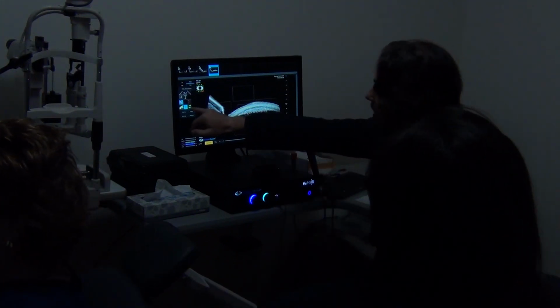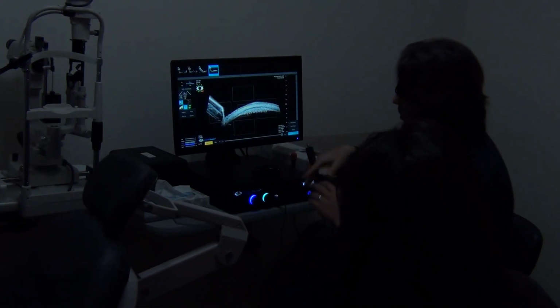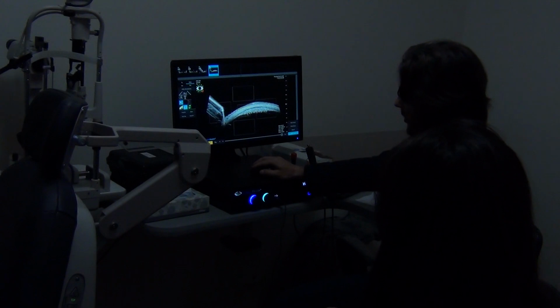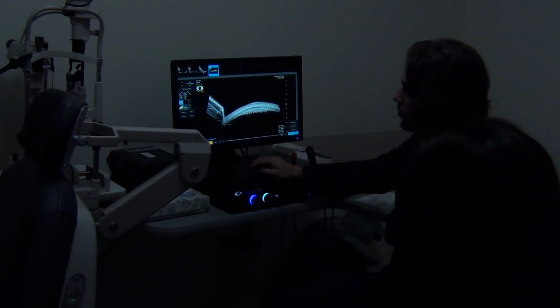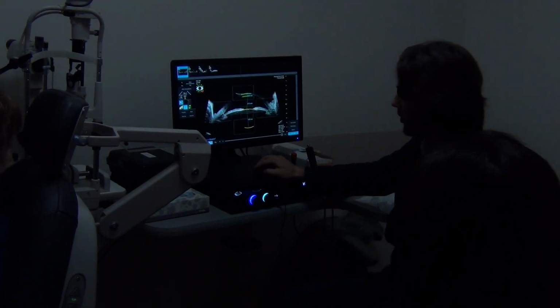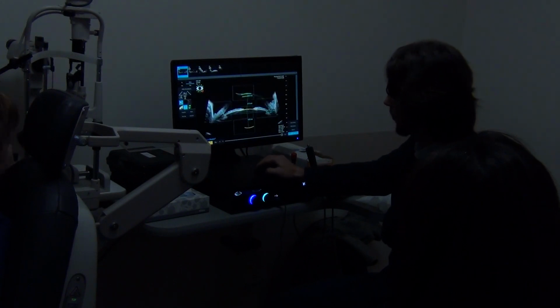Again, yes, eye tracking software is good only when you do sulcus to sulcus. The rest of the images is just gonna kind of be here. You can always take it off. You can shut it down even after you've done the scan and just review those videos. So we're gonna start with this first one. We're gonna play.